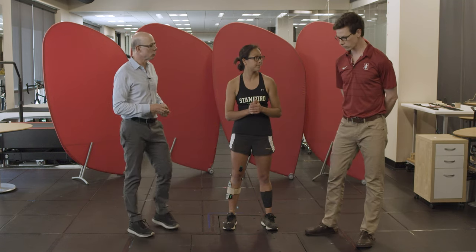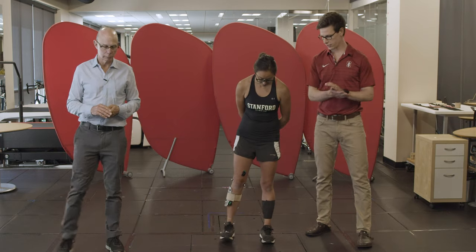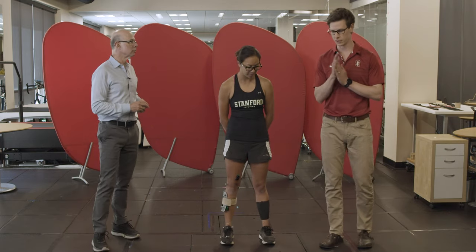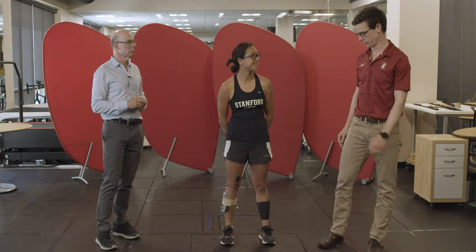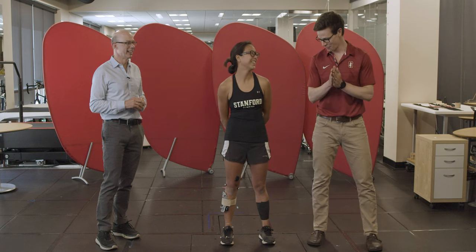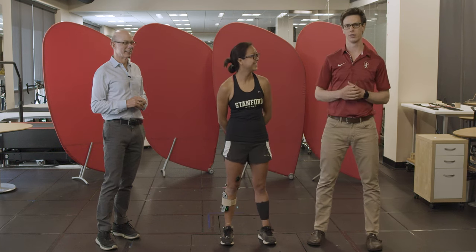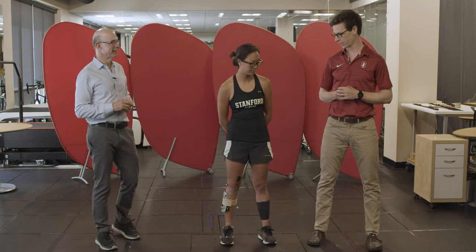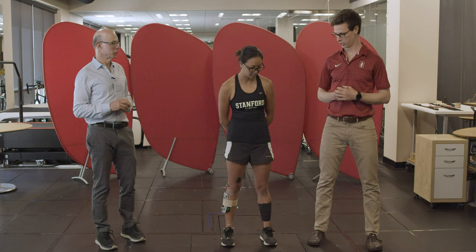Scott and Hannah, take it away to analyze the jump. We're going to have Hannah do a maximum height counter-movement jump — she'll drop all the way down and then explode and jump off the ground. We're going to look at a couple of things: the ground reaction force trajectory and what we expect those forces to look like, as well as which muscles are activating at different points during the jump.